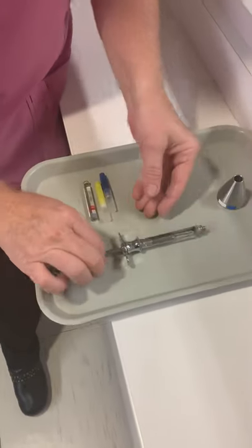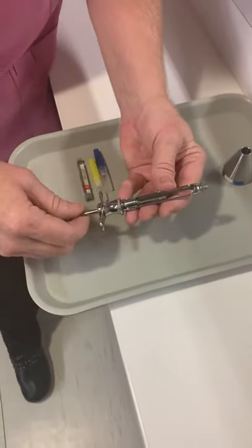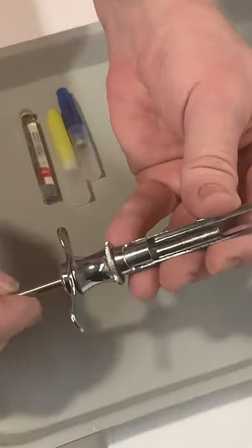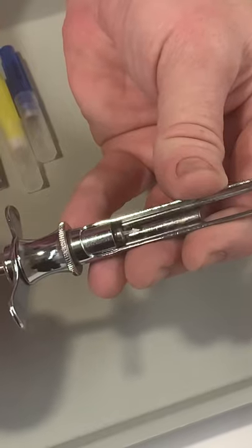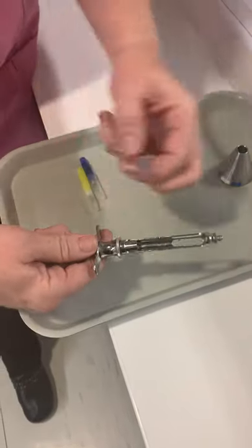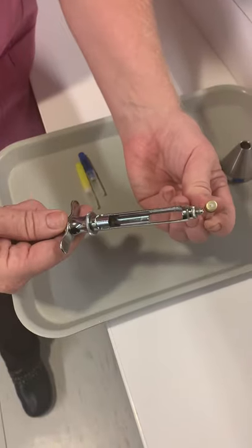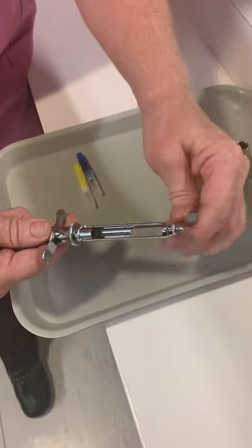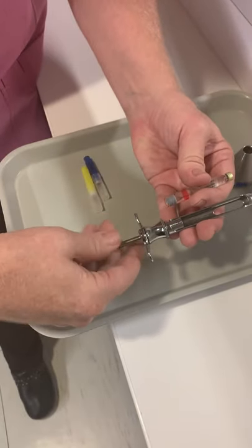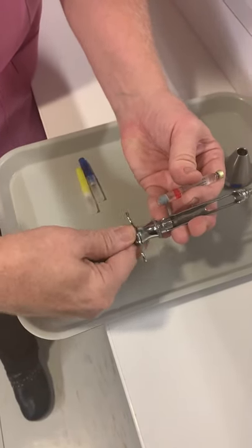We're going to load the anesthetic syringe. Make sure you are careful with the harpoon because it is very sharp. First, we're going to load the anesthetic carpule — one end is where the needle goes in and the other end is the plunger. Pull back to pull the harpoon back, then drop your carpule in.